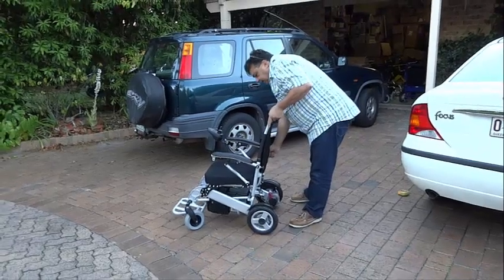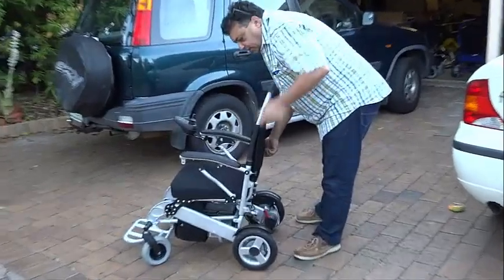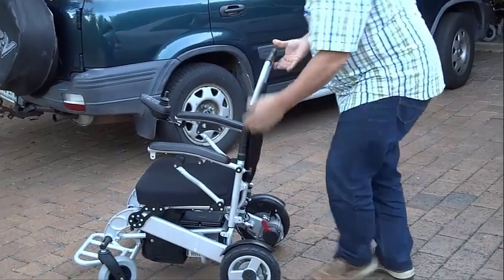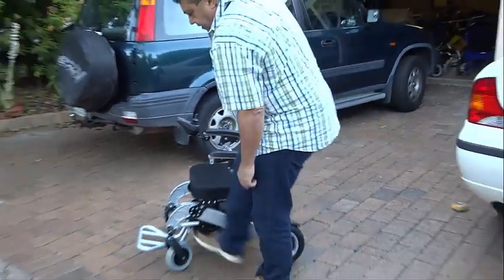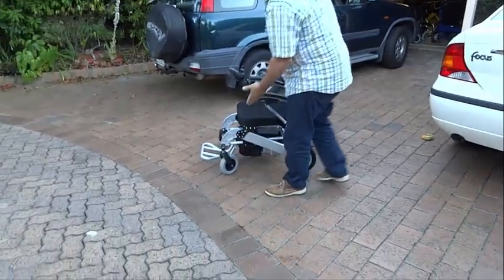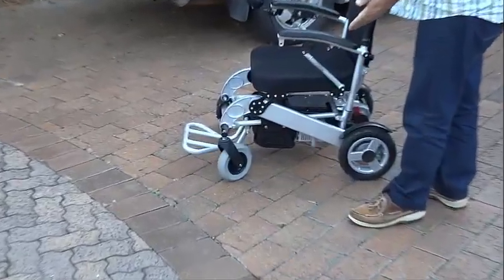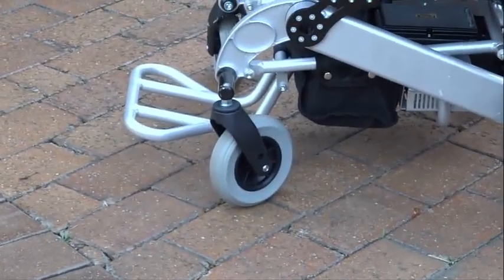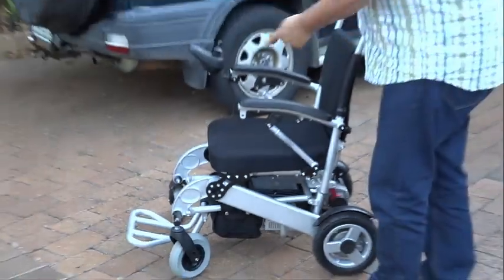Even though all PortaShopper wheelchairs are designed for portability, the PortaShopper Grand is great for tall passengers. It has an adjustable backrest to lift the backrest support by at least 30–40cm or 11–16 inches, so you can slip in one or two extra cushions to lift the passenger up and create 3–4 inches more footrest space.